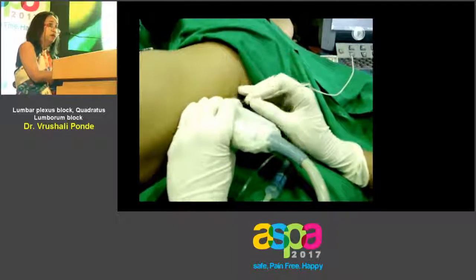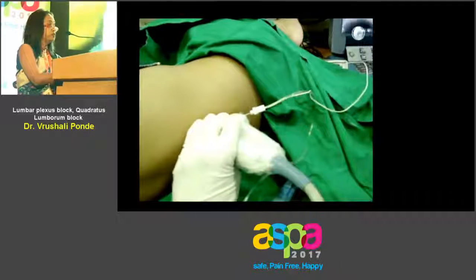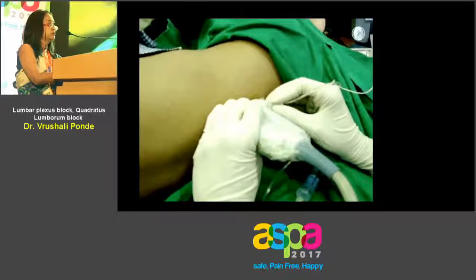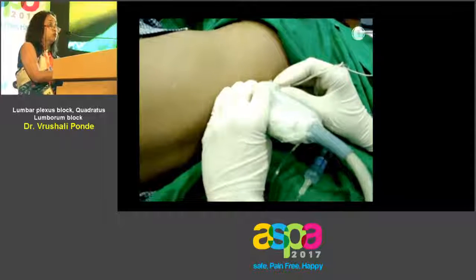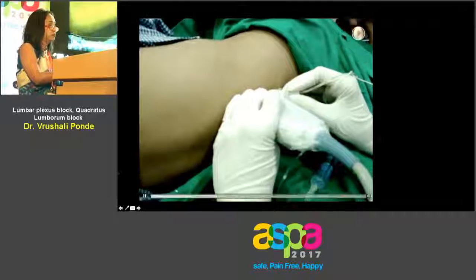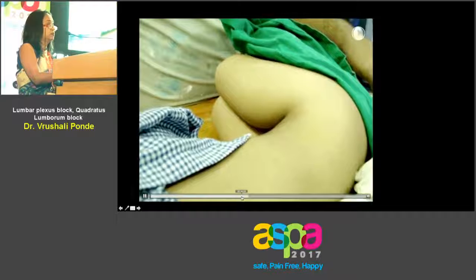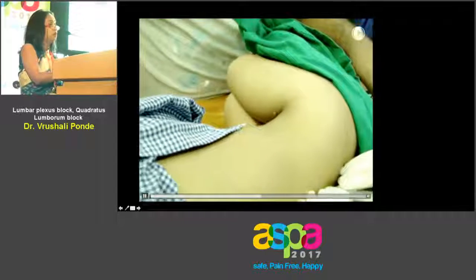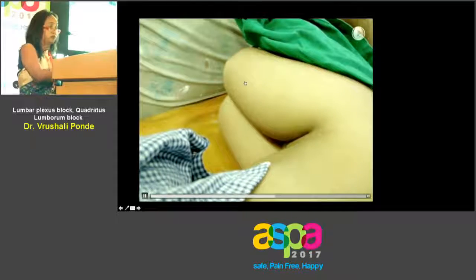But remember, again, the injection is always guided by the quadriceps contractions. So for a change, I'm going to depend on the endpoint which is given to us by PNS. This still is a slightly medial response, and we would be adjusting the needle to get the response of exactly the quadriceps contractions.